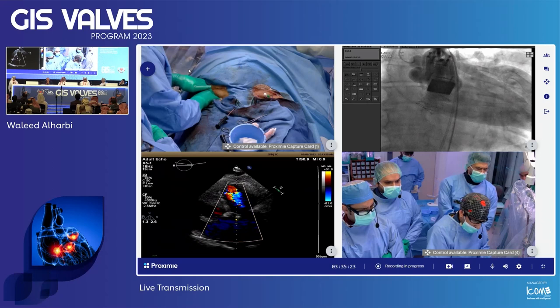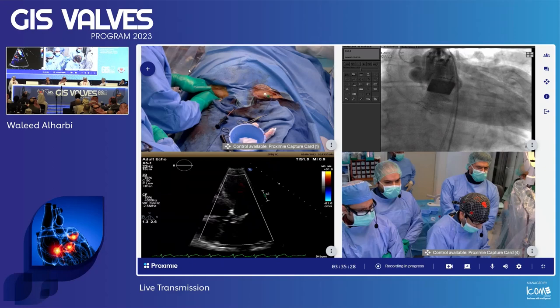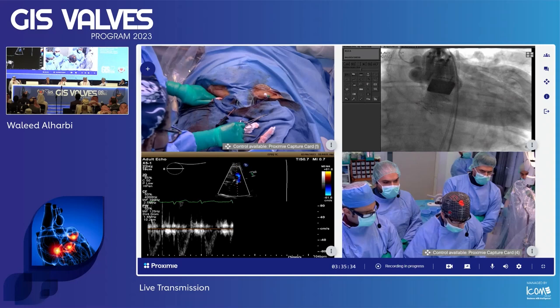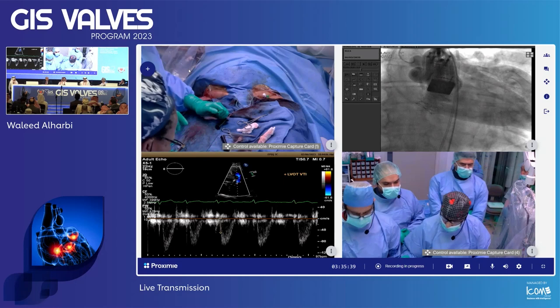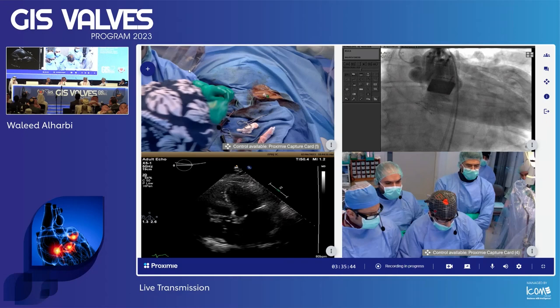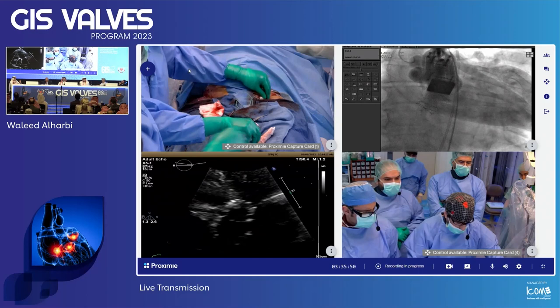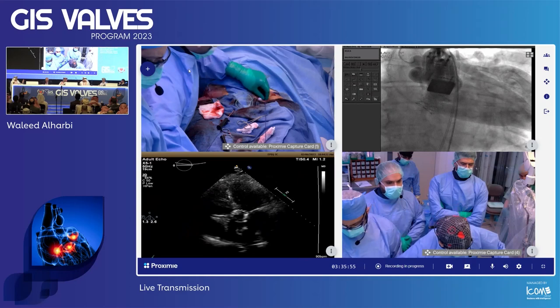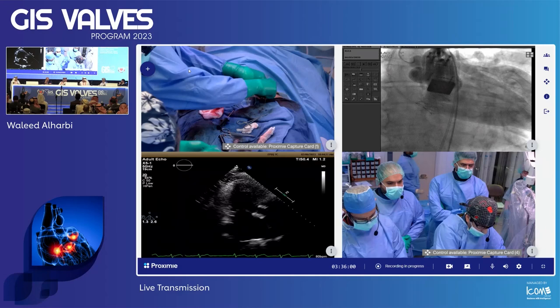The echo results are fantastic — zero leaks, mean gradient of four. Congratulations! For lifetime management purposes, even if this patient comes back in 10 to 12 years, we'll still be able to place another valve with a very good hemodynamic result. We have great results confirmed by aortogram, hemodynamics, and echo.